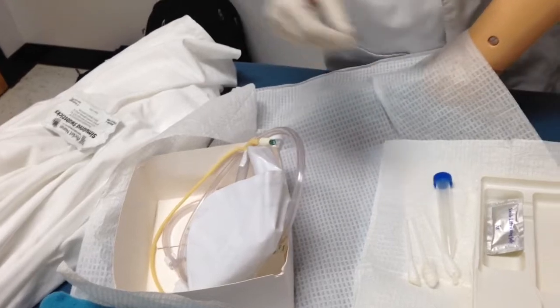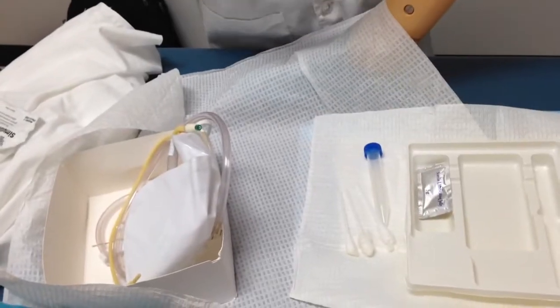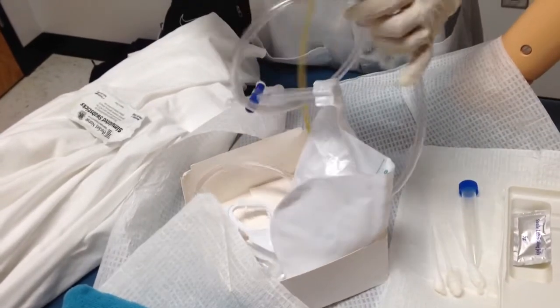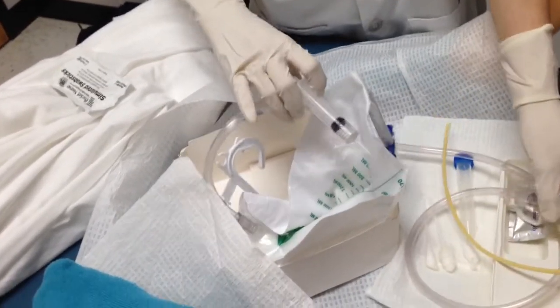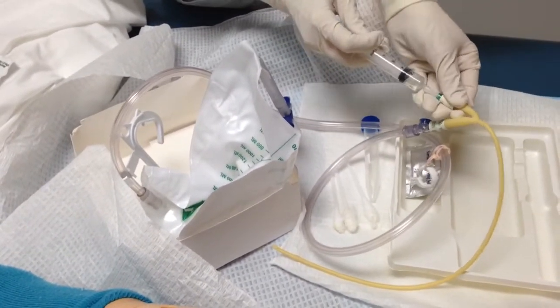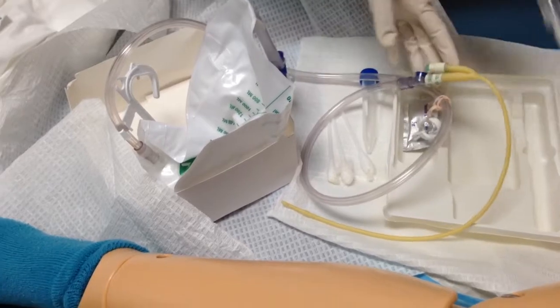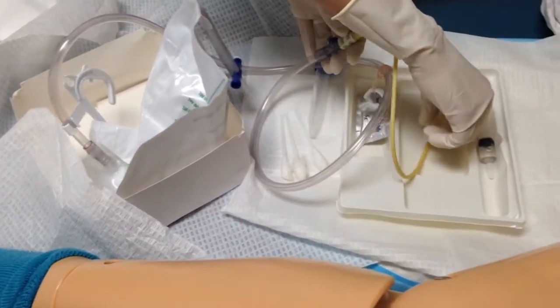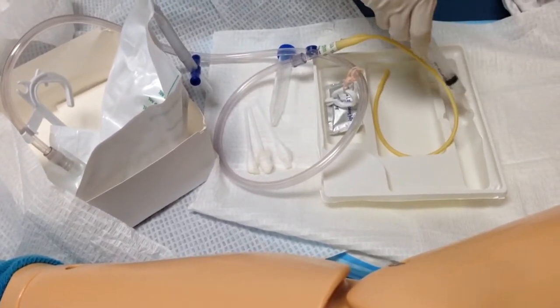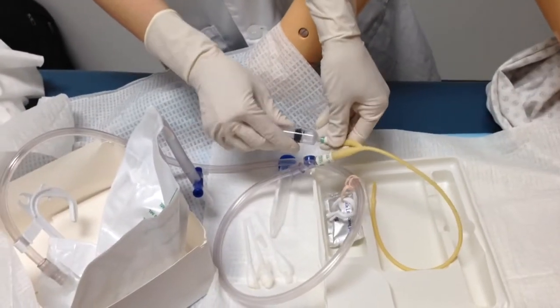What we're going to start by doing is taking the end of the catheter and lubricating it. After I go ahead, I'm going to take my syringe. We're going to test to make sure that the catheter is working, that the balloon is. So I'm going to insert roughly 10 cc's of solution, make sure that the balloon does indeed work, and then we will take the syringe out, go ahead and place the tip of it in lubricant. And now I'll place this back in here, and then I'm going to go ahead and clean you up.